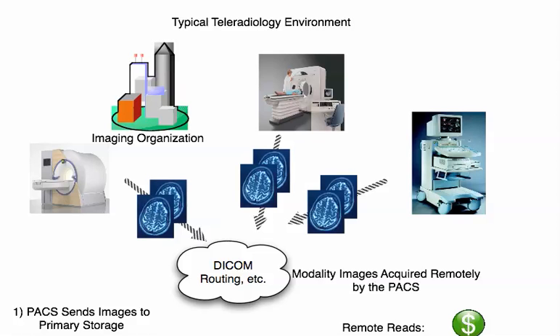In today's brief 5-minute video, we're going to look at a typical teleradiology environment, and we're going to do that in the context of storage. We're starting to see a trend where a significant number of teleradiology organizations are being pulled into the long-term archive and storage business for their clients' diagnostic study data.